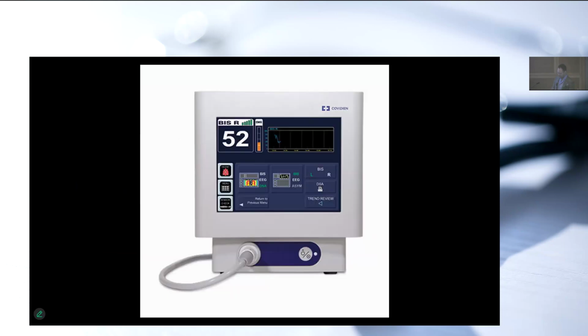And it all but disappeared from anesthetic practice until this device was launched. This is the BIS. It was put on the market in 1994. It basically takes EEG data in and spits out a value between 0 and 100. 0 is this object, and 100 is you all and me, ideally, awake patients. And somewhere in between, you would have an anesthetized patient. And it was just an absolute success, this thing.